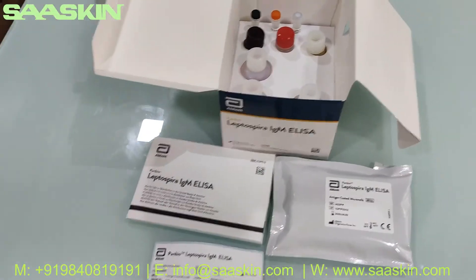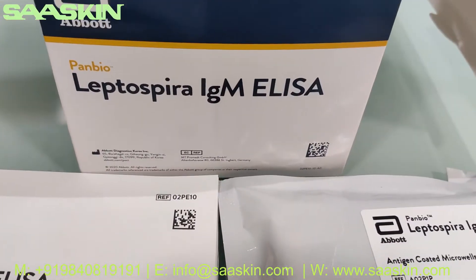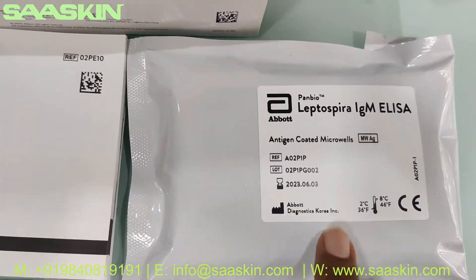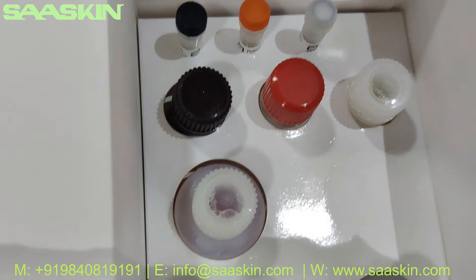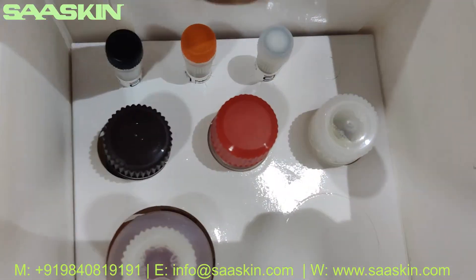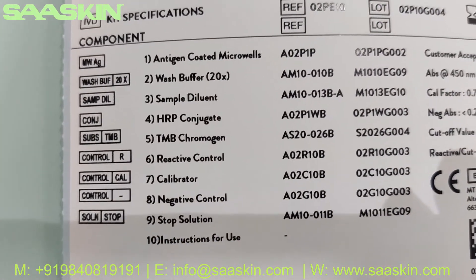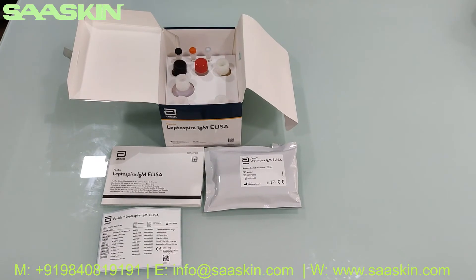So to quickly summarize, this is the Abbott Panbio Leptospira IgM Antibody ELISA test kit, a 96-well plate kit. It contains the instruction manual, the reference sticker, the 96-well plate, all buffer solutions including the HRP conjugate, sample diluent, stop solution, TMB chromogen, negative control, calibrator, and positive reactive control. The sticker clearly lists all the contents inside the box. That's the overall introduction of the kit — thank you.